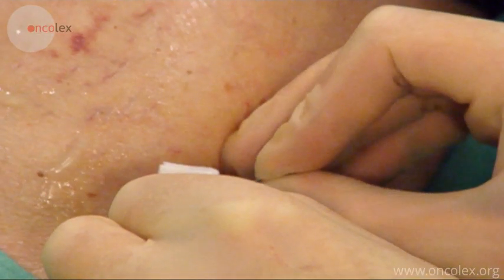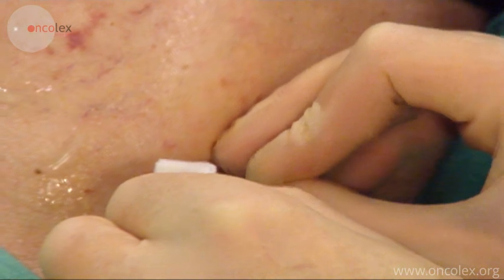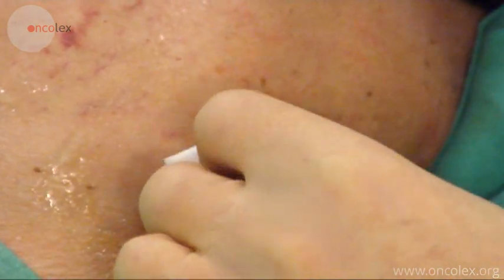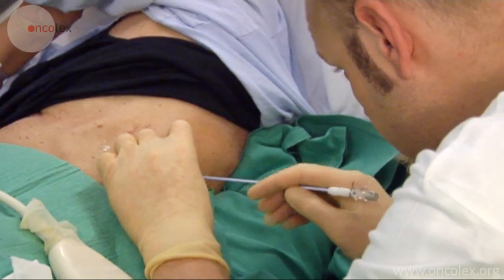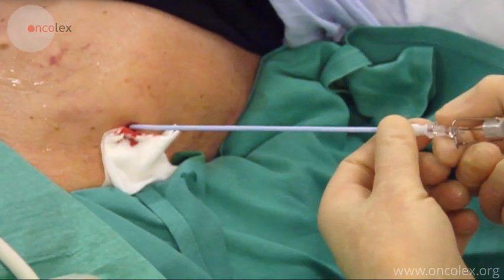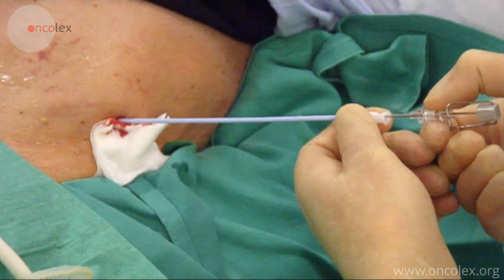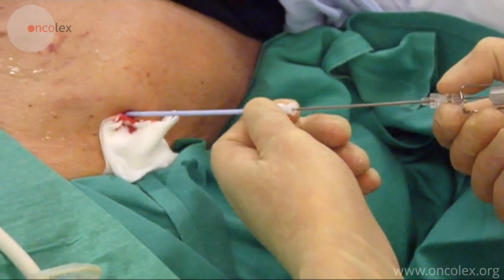A small incision is made in the skin with a scalpel blade. A pigtail catheter is inserted into the pleural space. The introducer is retrieved and a three-way tap and tap bag are attached.